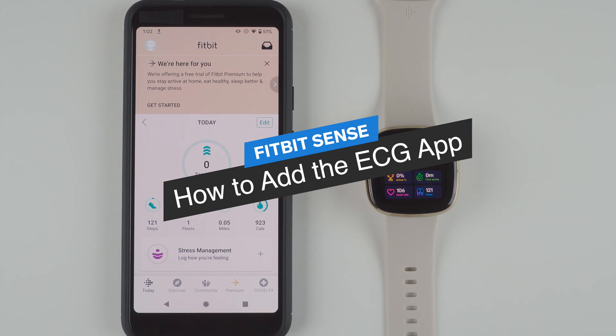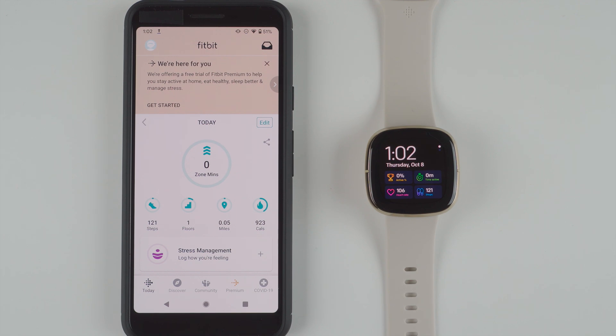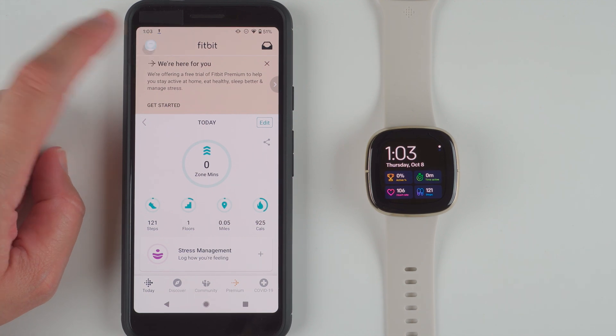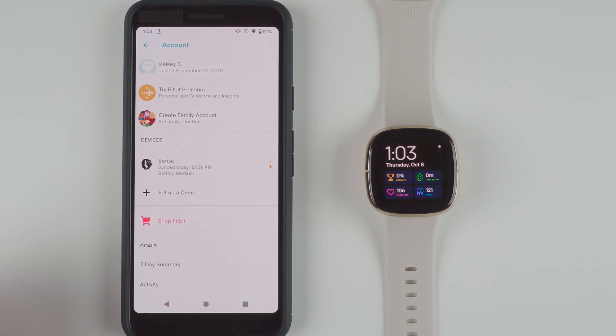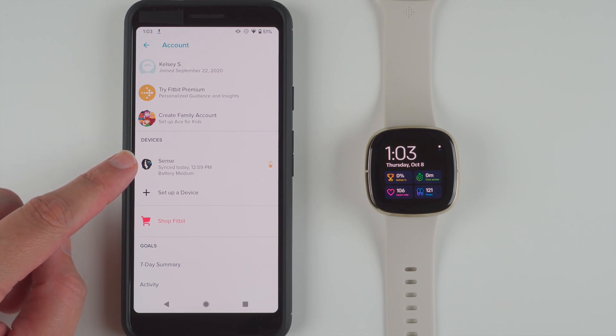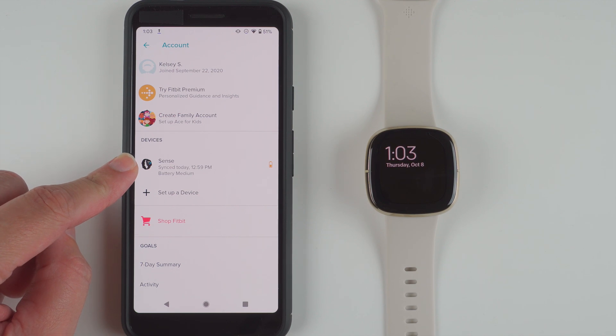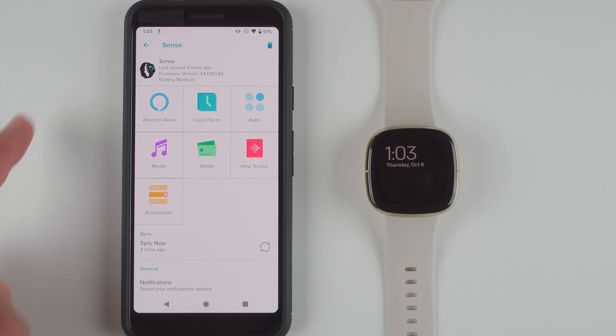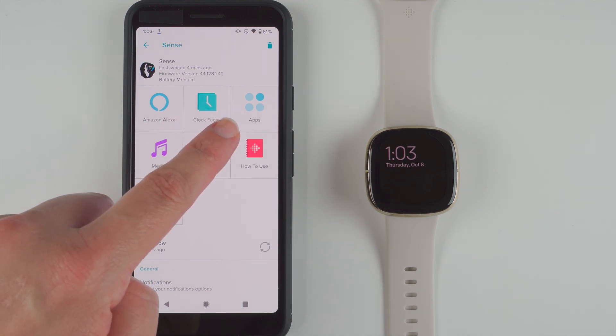You'll need your Fitbit app and your Fitbit Sense. Starting in the Fitbit app on the Today tab, in the upper left hand corner you should see an icon — go ahead and tap on that. This brings you to your account settings, and under devices, or if you're on an iPhone you'll just find the row that says Sense, then tap on that. Over here you'll find Apps — tap on that.